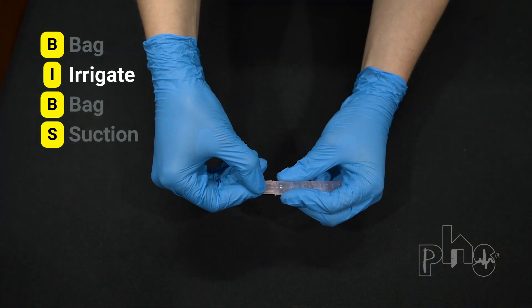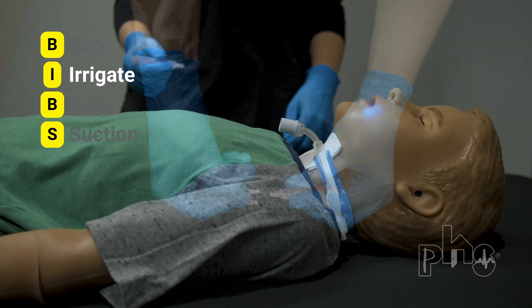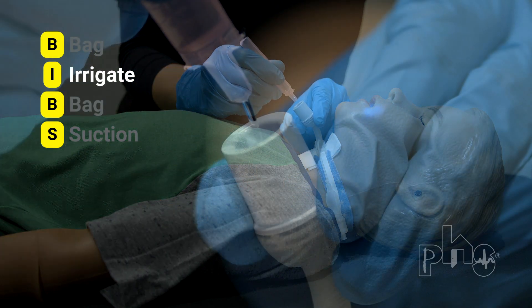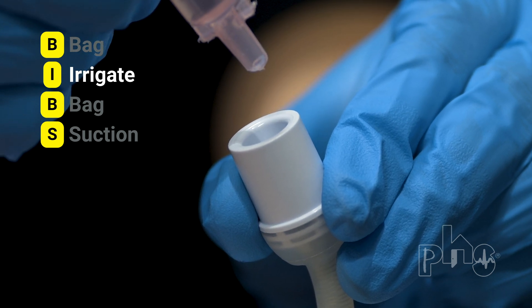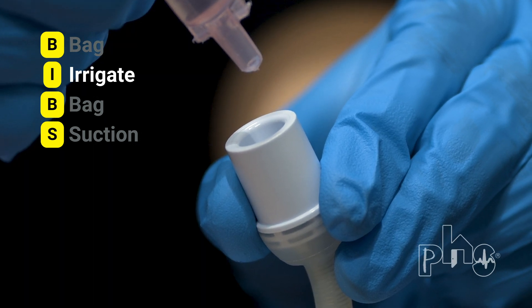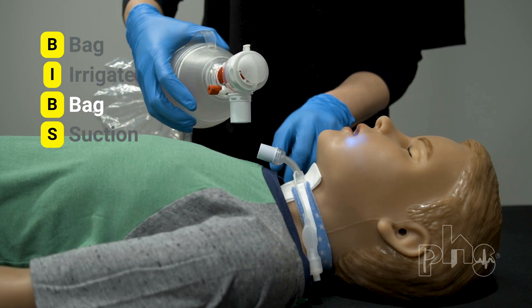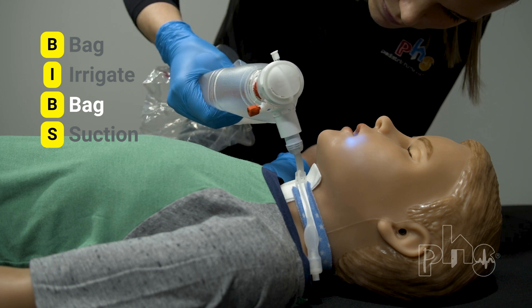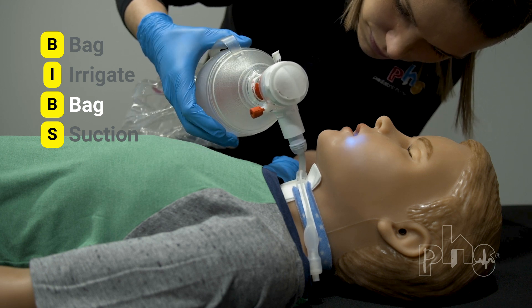I is for irrigate, which means putting saline into the trach tube. Remove the resuscitation bag from the trach tube. Take a saline tube and squeeze up to two milliliters into the trach tube. Follow instructions from your child's health care provider on how much saline to use. B is for bag, which means use the resuscitation bag again. Squeeze the bag about three to four times to give breaths. Watch for chest rise each time you squeeze the bag.